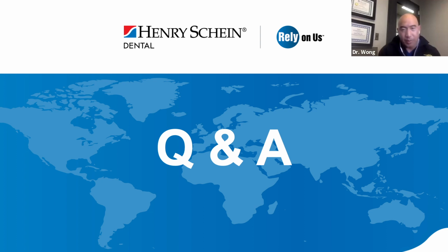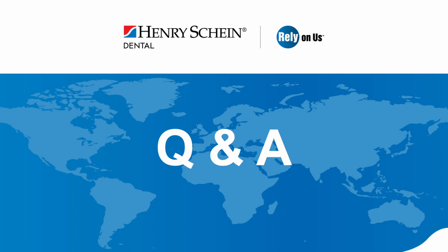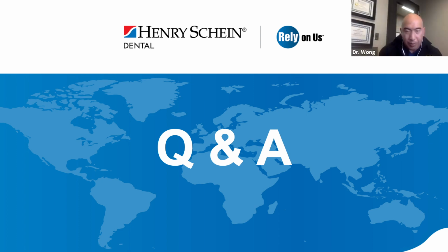The problem is that not all implant companies make wide healing abutments, so you end up having to customize it yourself. Do you standardize the size of healing abutments you use per tooth type? For example, a particular size for molars, premolars, etc., or is it always case dependent? For me, it's always case dependent. And the reason is because molars, as an example, can range in size.